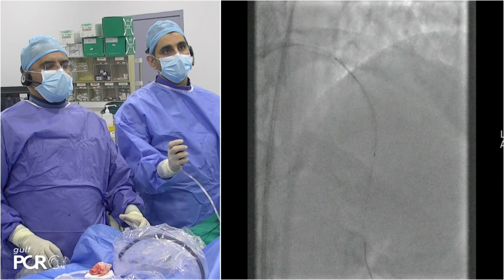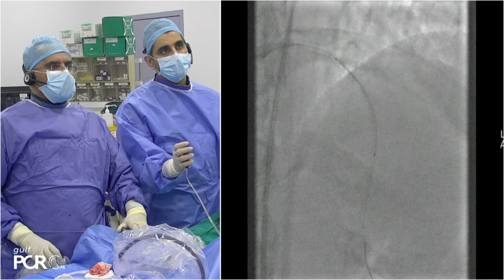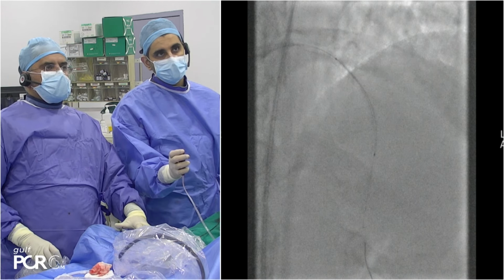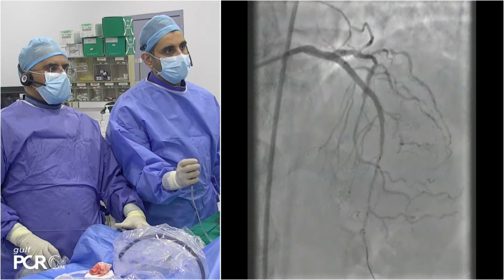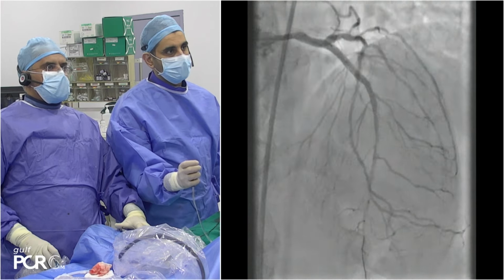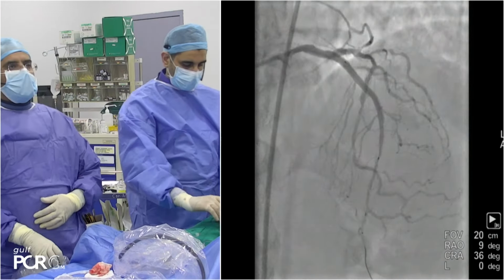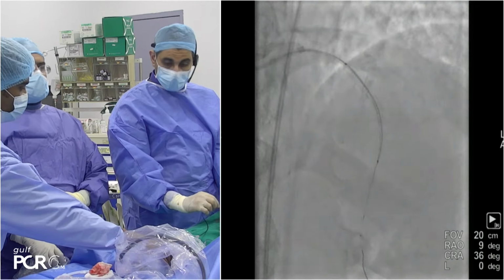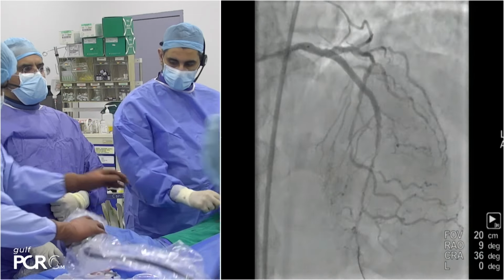When you are working after the stent implantation, we have to work within the stent. Be careful not to place the balloon distal to the stent, because immediately we create a dissection. And you're right, it's very difficult now, if you need an additional stent, to decide the diameter and the length, because there is no good distal area to place a stent.